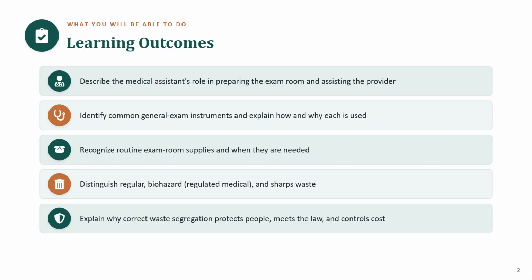Here's our roadmap for this lecture. First, we will frame your role. You are not a bystander in the exam room. You're the person who makes the visit run smoothly. Second, we'll go instrument by instrument through the tools used in a general physical exam, and for each one, I want you to know two things: what it does and why the provider needs it.